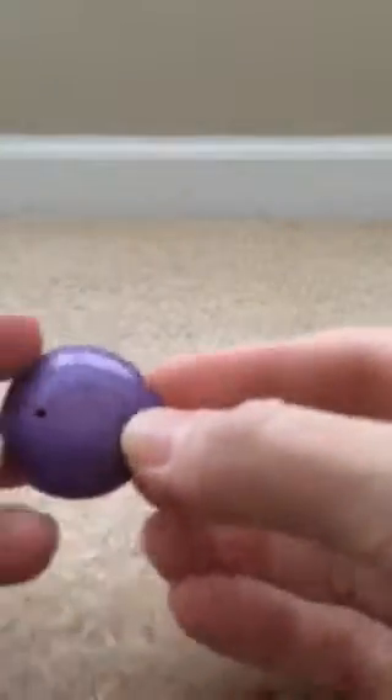Sometimes the universal headpiece breaks and just needs to be replaced. I want to show you how the magnets are in there — there are two pieces of foam just to keep it from rattling inside.